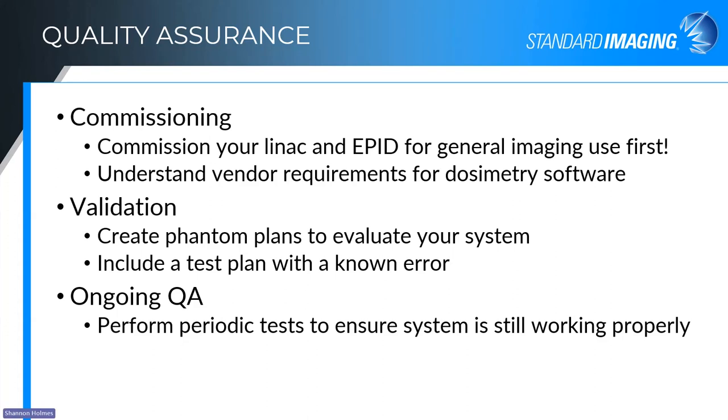Yes, and it's important to understand what your clinical, site-specific tolerances are for your system to help start setting the stage for that. You don't want to set your system up so tightly that you're getting alerted for things that are within tolerance, because you're looking too finely at your tolerances. So you really need to understand that. And I think we talk about that in the next slide, perhaps.